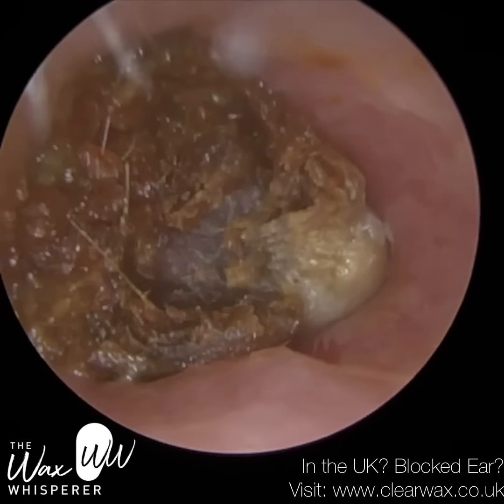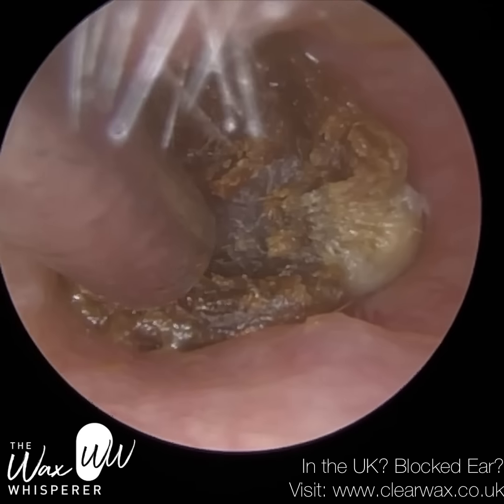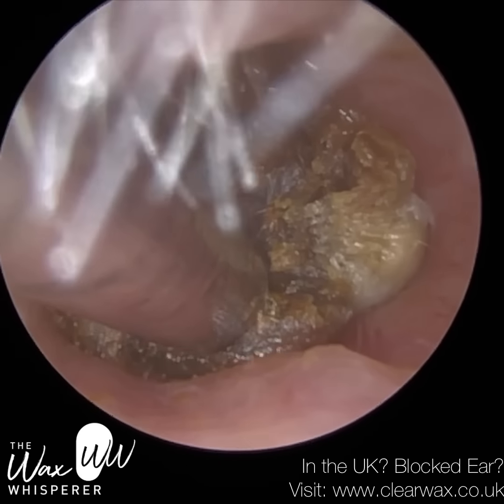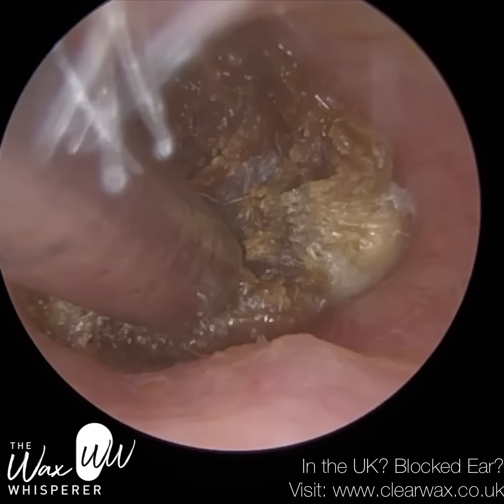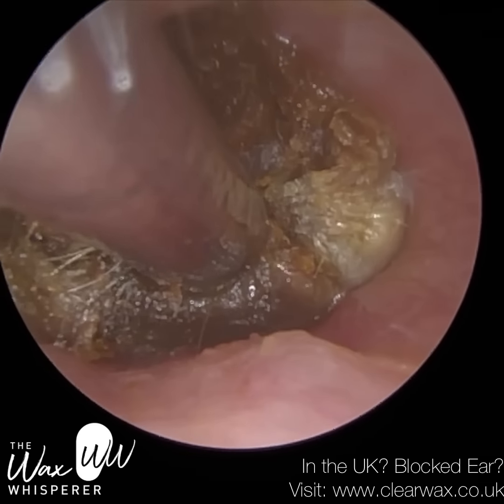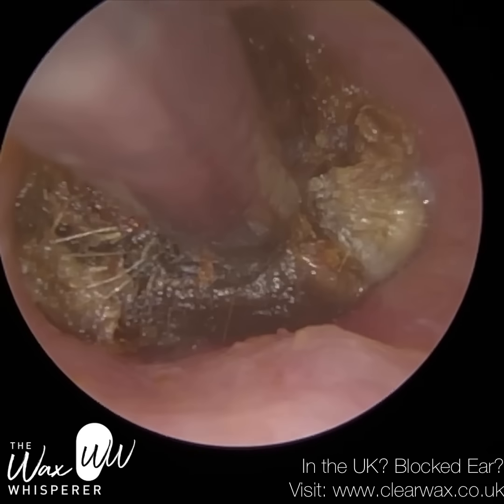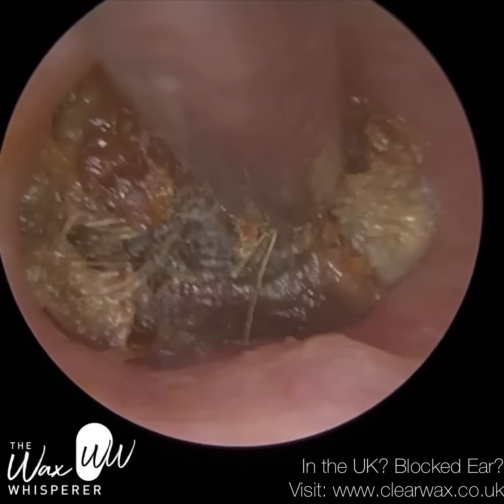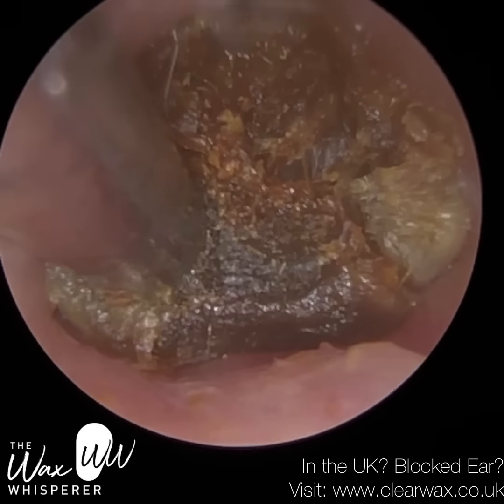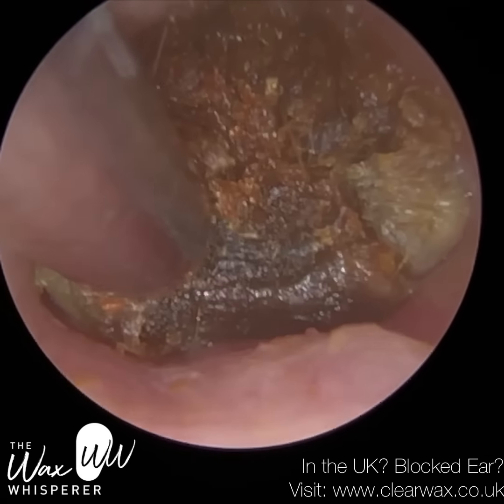I used a hook on several occasions already, and forceps. Now, with this type of keratosis obturans, because of the consistency, because it's like chewing gum, it was so frustrating because I managed to get the hook in behind the wax plug, or the skin plug, sorry, and as I rotated the hook and started bringing it forwards, it just cut through like a hot knife through butter. It's so frustrating because I thought, we've managed to get the ear hook really deep into the ear, above and over the skin plug and behind it, and all I have to do now is slowly bring the hook forwards, and as I do, this plug will come out, and unfortunately, it didn't. It just cut through, it dissected through it.